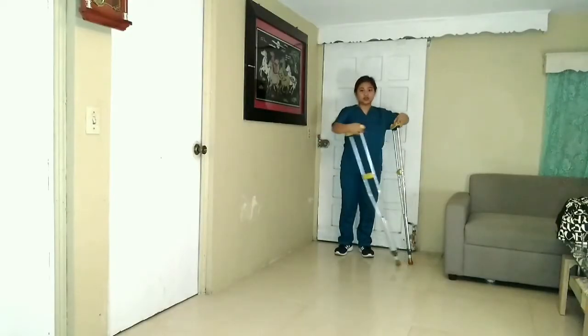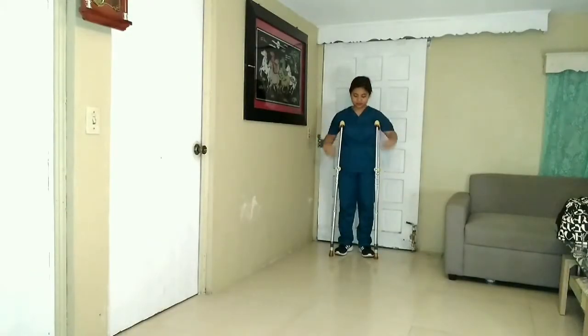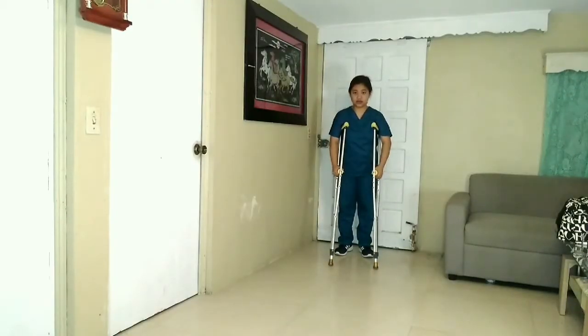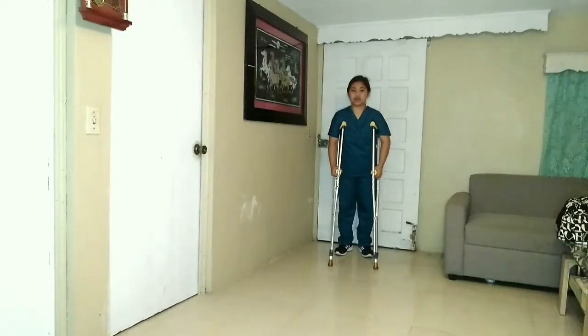Instruct the patient to use the swing through gait. Begin with tripod position. Move both crutches forward. Lift and swing the leg through and beyond the crutches.